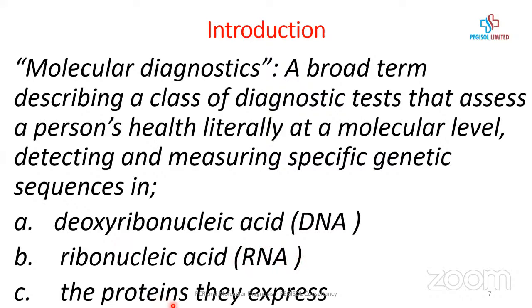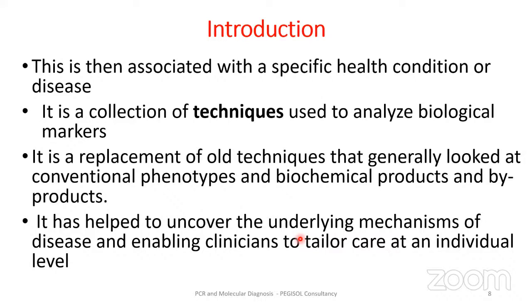So no matter the sample you're working with, whether blood samples, urine samples, hair samples, and whatever, everything now boils down to these three concepts, which I call the tools of molecular diagnosis. I'm sure you will pick it from here to understand that everything you do in molecular takes bearing from this point. That is your specimen. So irrespective of what sample you're working on, you're going to extract a DNA from it to work with, an RNA, or a protein. And you're doing all that with an association with a specific health condition or disease.